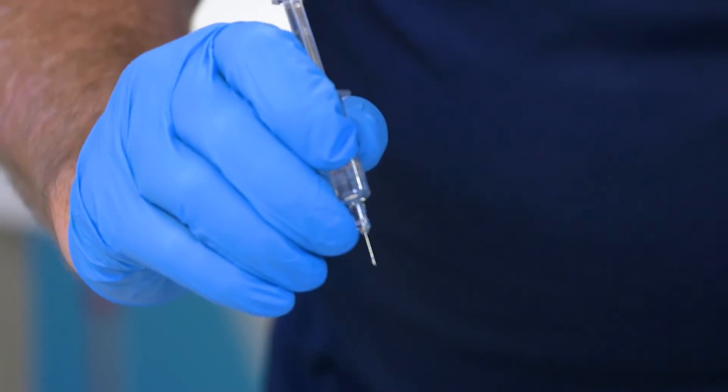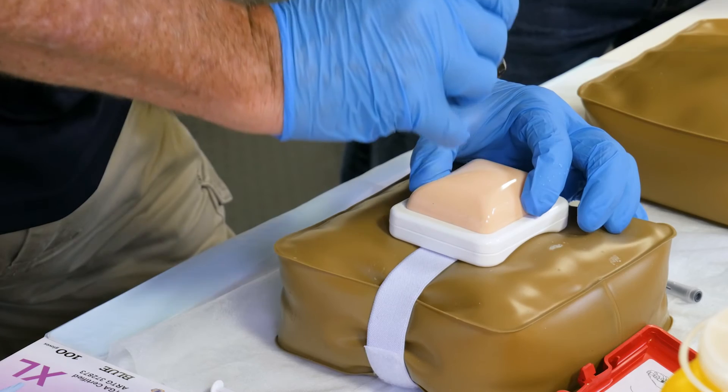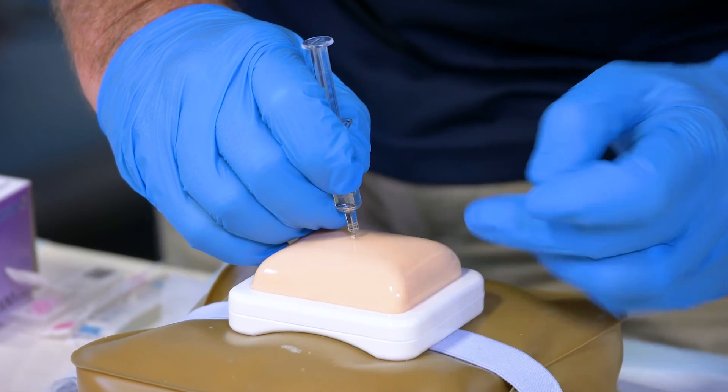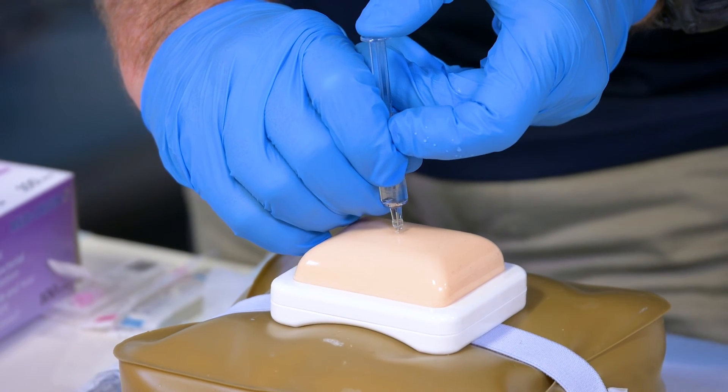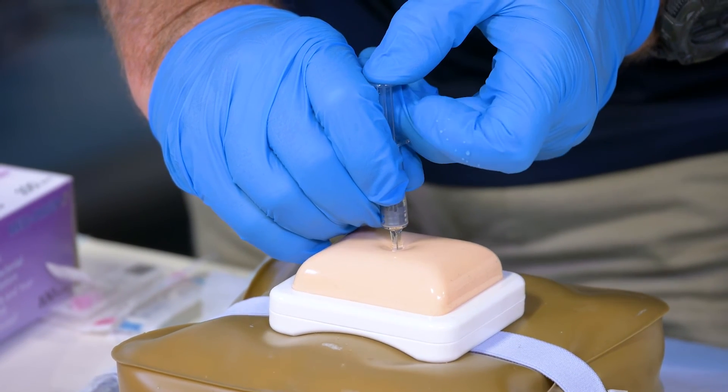As before, you've already cleaned this area. Go in at 90 degrees. Blood hasn't aspirated back into the syringe. Use the other hand and actually push it down.